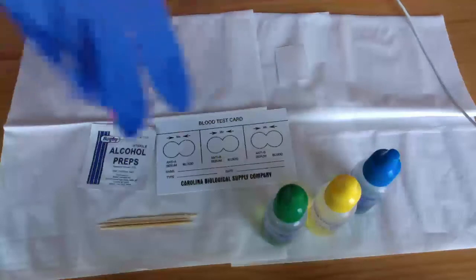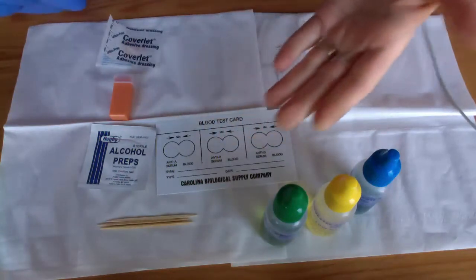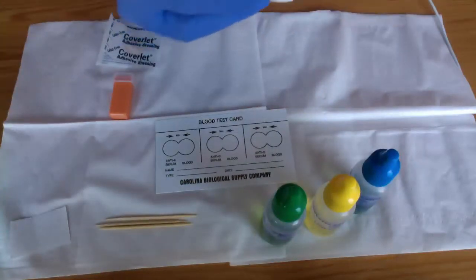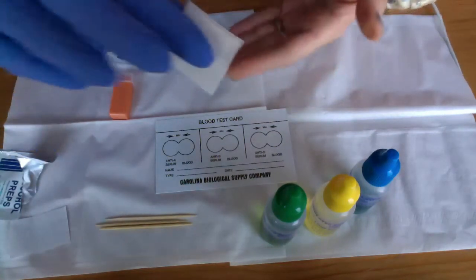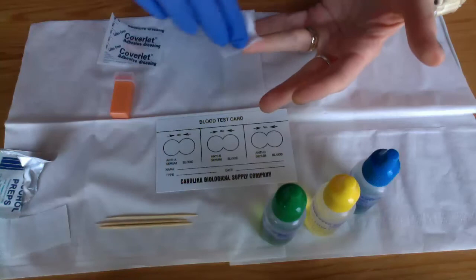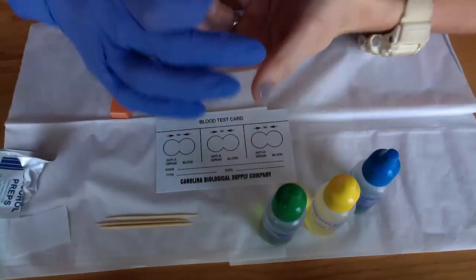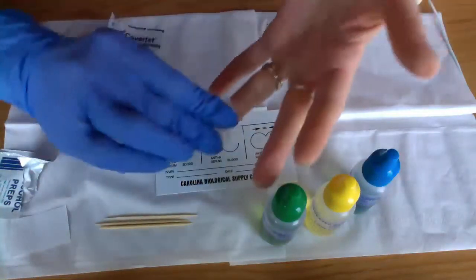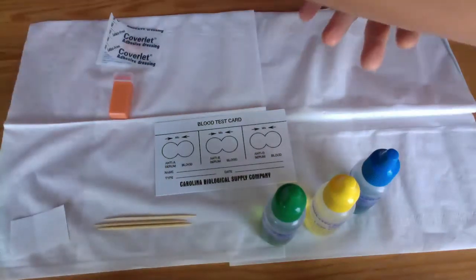What you're going to do is glove your writing hand, whatever hand you write with. Then you take your other hand. For me, it'll be my left hand because I'm right-handed. You're going to use the alcohol pad to clean your distal fourth phalanx. Remember, you start with the thumb, 1, 2, 3, 4. The fourth phalanx is your ring finger, and you're going to clean that with the alcohol pad. Give it a second to dry.